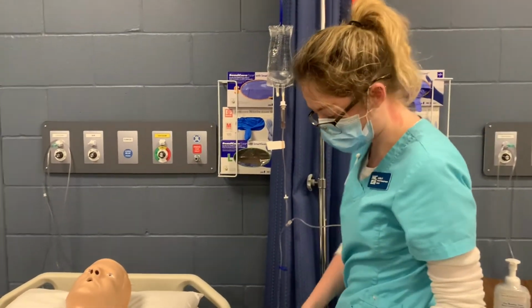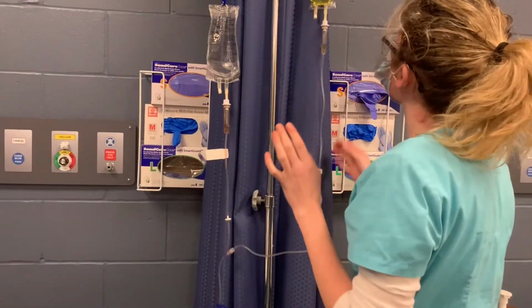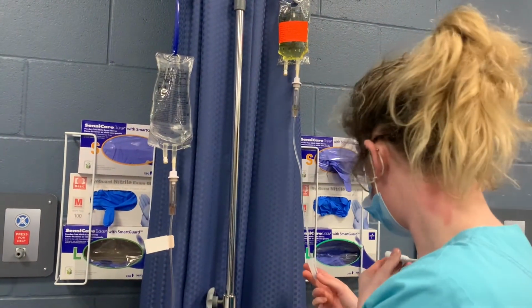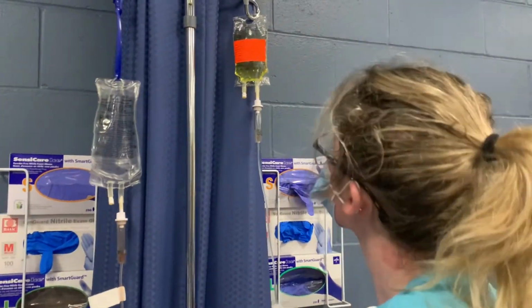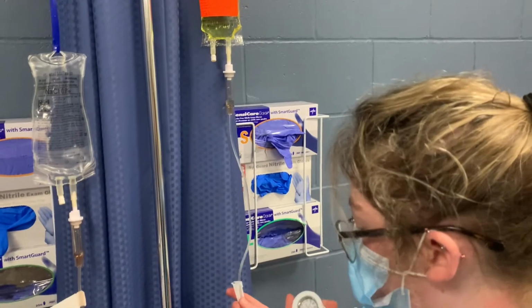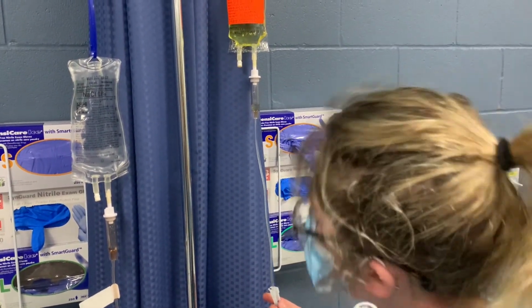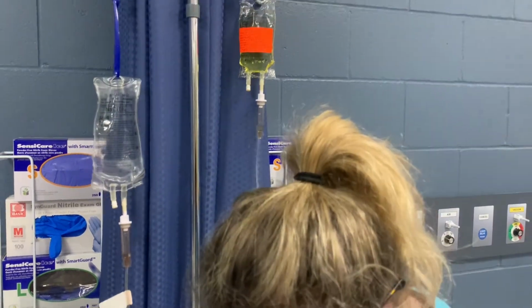So I'm just going to put it in the garbage so that I can actually calculate the flow rate. And it will be around 9 drops per 15 seconds. I have my watch here. I just very slowly ensure that all the tubing is open.